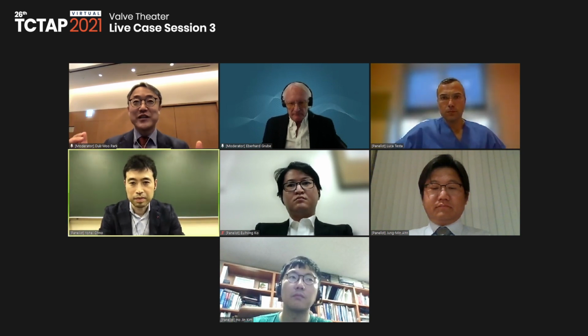Thank you. Yohei, how do you think about your routine valve position? Nowadays the trend is that shallow is better. How do you think? Exactly. Well, we have to think about two things. One is to avoid new onset conduction disturbance, and another is future coronary access or coexisting coronary artery disease. In this specific case, I think the Valsalva is large enough for future coronary access. So even with the Evolut series, I guess coronary access after the TAVI procedure would be feasible.